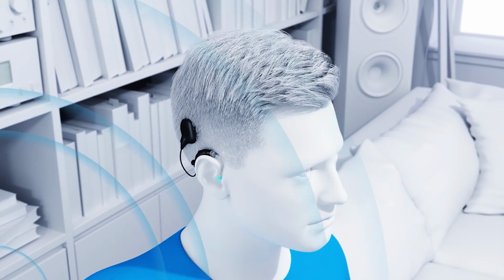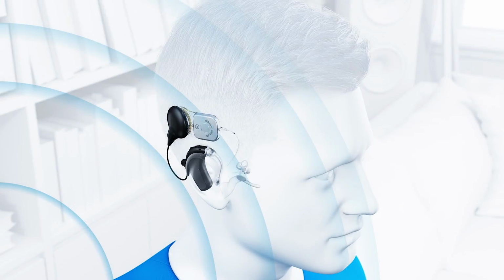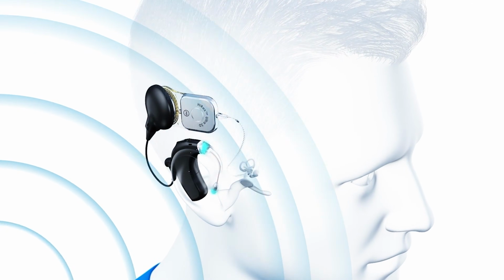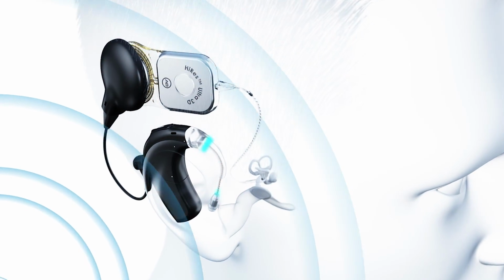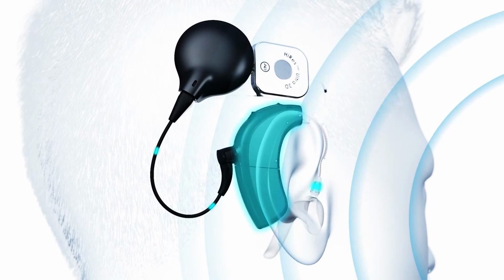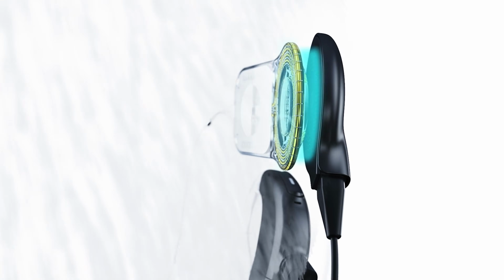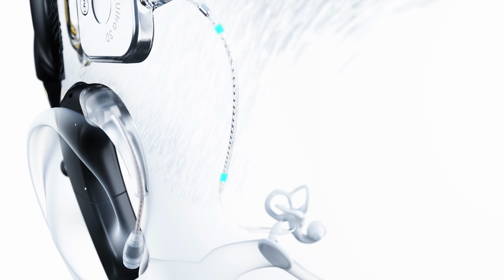The internal portion of a cochlear implant consists of a receiver and a magnet that is implanted under the skin, and an electrode array that is implanted into the cochlea, which is your hearing organ. The external portion of a cochlear implant consists of a processor that has microphones to pick up sound, and either a disposable battery or rechargeable batteries, and a transmitter that also has a magnet that holds the transmitter over the receiver that was implanted under the scalp.